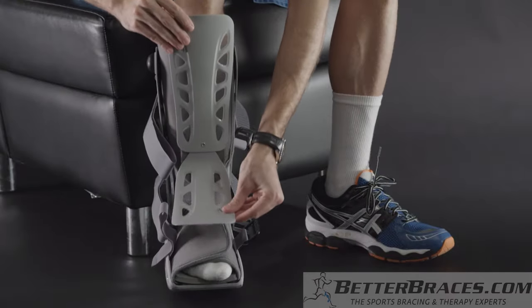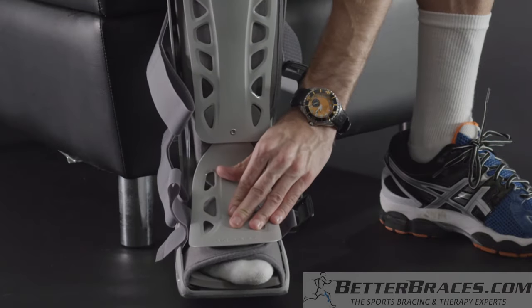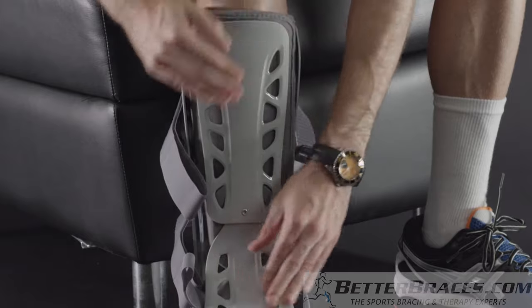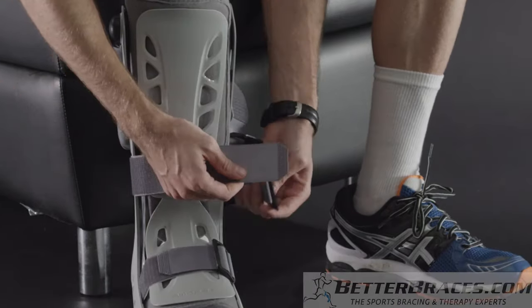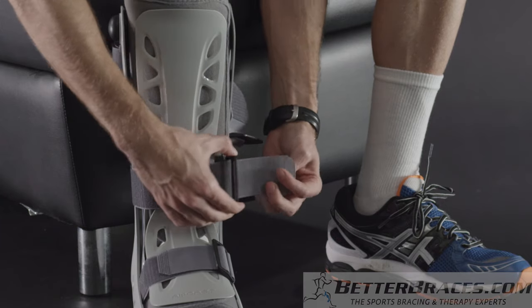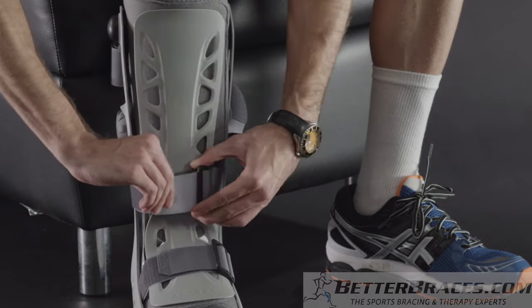Next, replace the front panel. Position the front panel so the AirCast logo is over the toes, and the upper part of the panel is secured to the liner. To complete the application, secure the straps from the bottom of the boot to the top. Tighten the straps until the boot is snug yet comfortable.